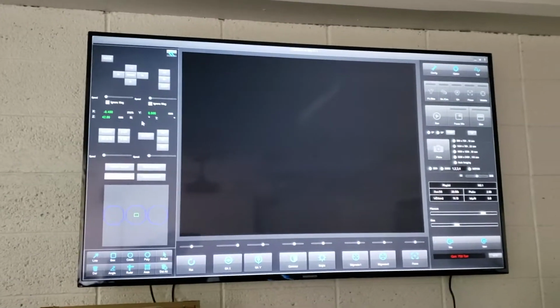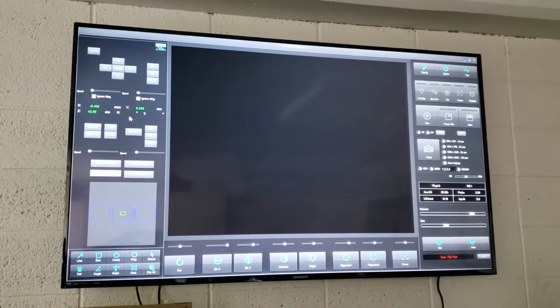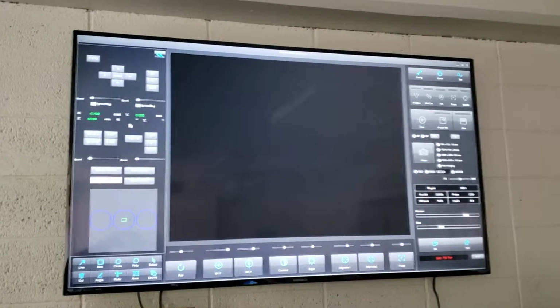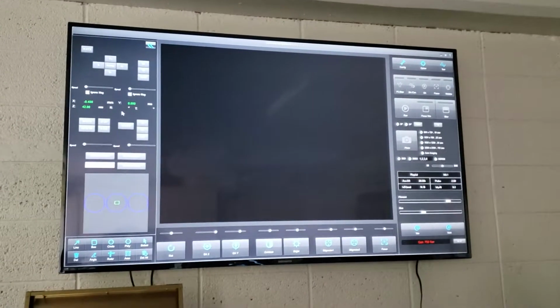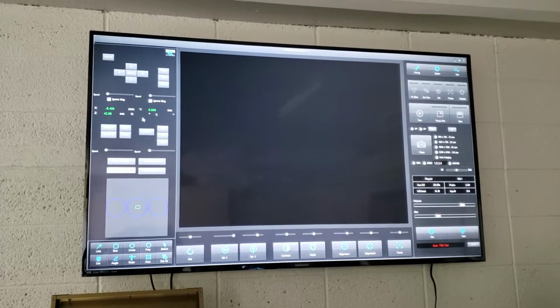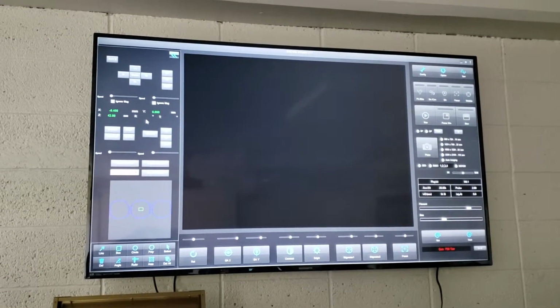But if you decide to shut this thing off every night, well, in the morning, make sure you home the stage. Home the stage, center the stage. Now, how can it center it when it's not in? It's got references that are programmed in the EEPROM where the stage position is, so that it knows where the home base is.